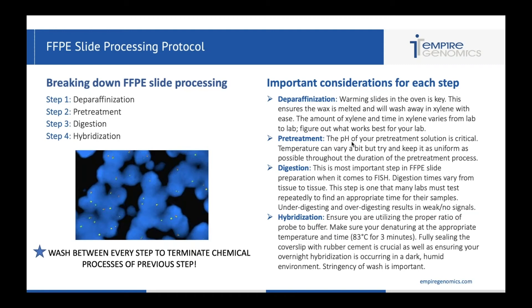Digestion is by far the most important step of FFPE slide processing, and it's the step where I see so many problems because each tissue is unique and different tissues can require different amounts of digestion time. If you're having tissue issues, look at digestion first because that's typically where the issue lies. Under-digestion and over-digestion often result in weak or no signal. You and your techs should become comfortable being able to distinguish the morphology of the tissue and what looks like proper digestion, because that's going to yield the best result.